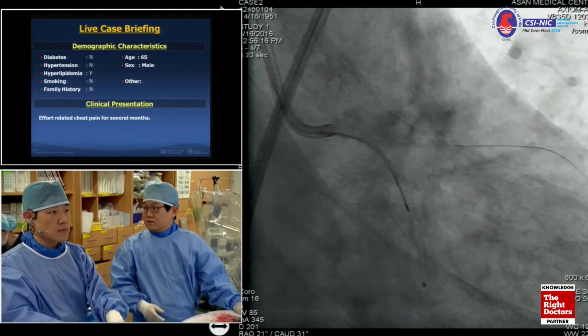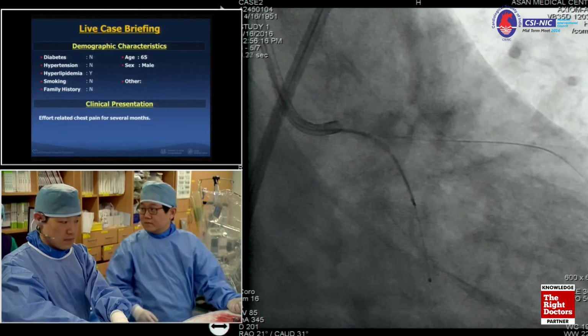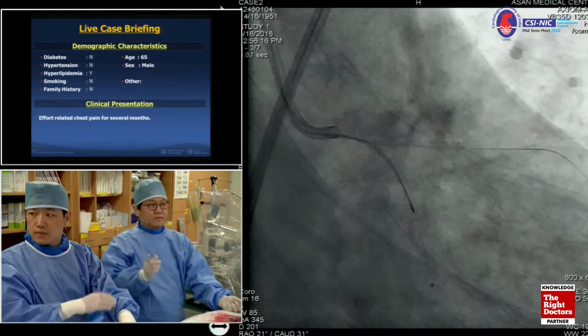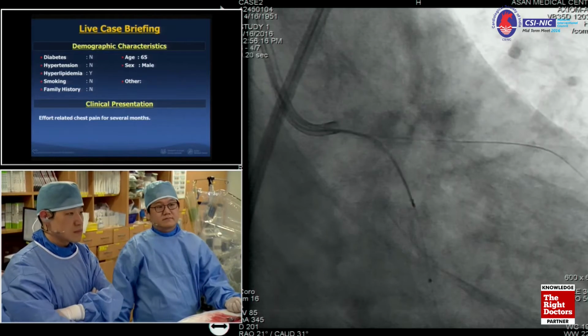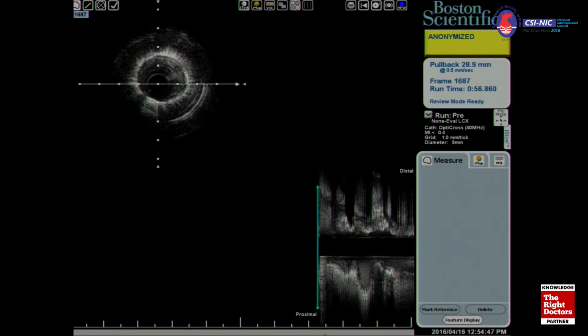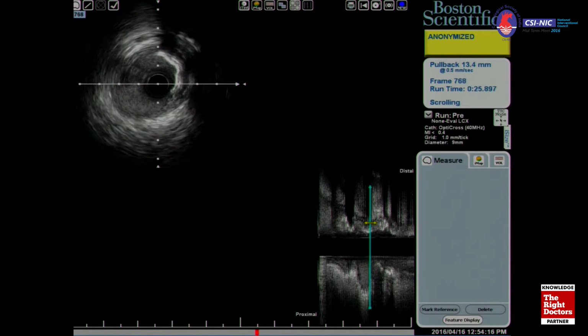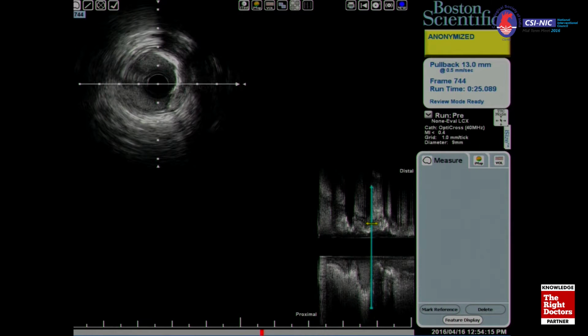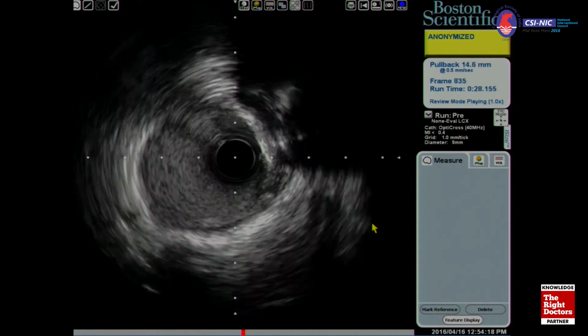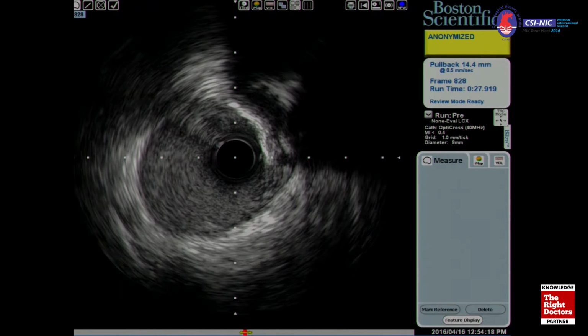Let's see the... Okay. Did you do the IVUS for both? Yes, both. Would you show us the IVUS? There's a run from LAD? This is the circumflex run first, right? Yes. Would you show that? From the distal? From the distal. Size-wise, it's a very big one, right?